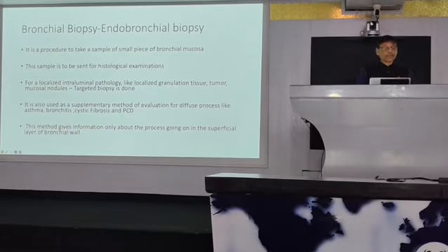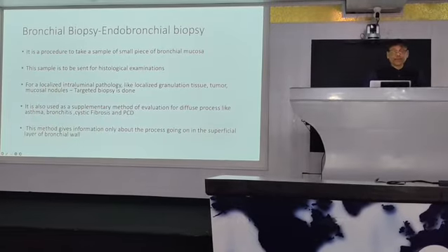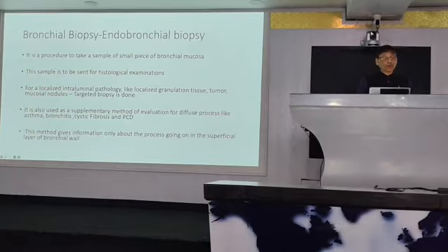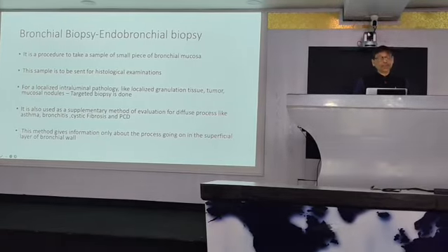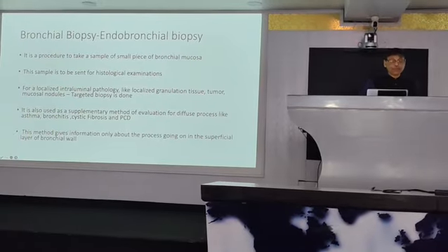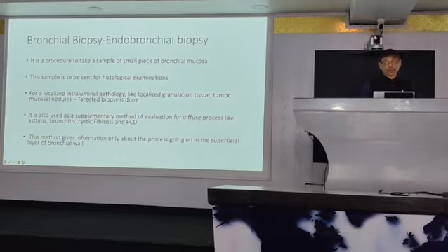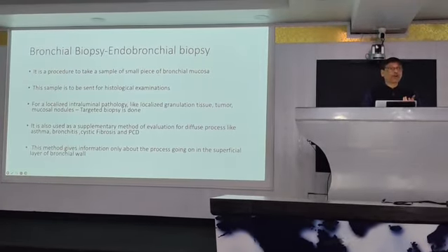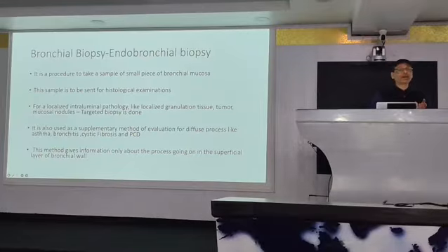This is best for these. It is also used as a supplementary method of evaluation for diffuse processes like asthma, bronchitis, cystic fibrosis and PCD. So we can do this in these conditions also. This method gives information only about the process going on in the superficial layer of the bronchial wall because this is endobronchial biopsy. We are just taking biopsy from the mucosa.